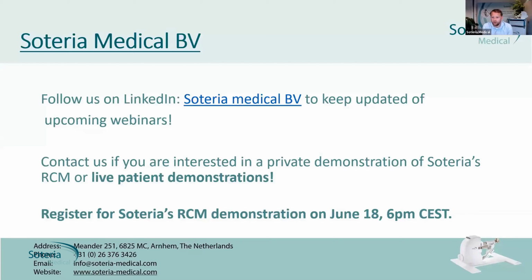So thinking about the future, do you think that eventually all patients will be done with targeted biopsy only? And will that then be done in the MR, or will it be done in different ways? That is a possible scenario, but then we face the problem of MRI availability and cost, because now we do it on selected patients. The majority go with the standard fusion. Maybe in the future we will do more, probably we will do more.